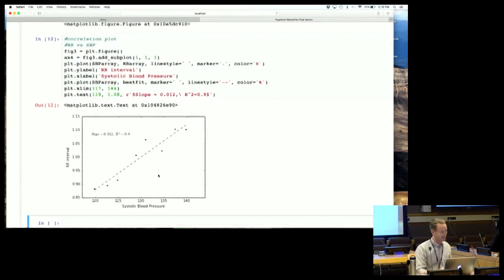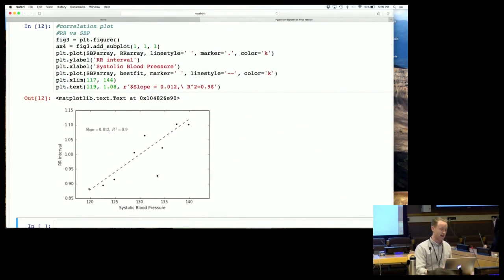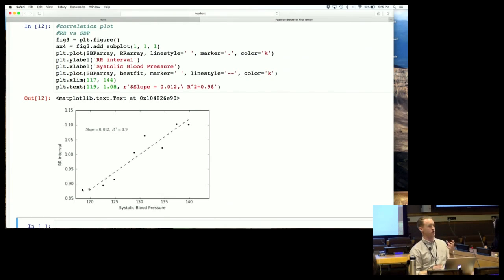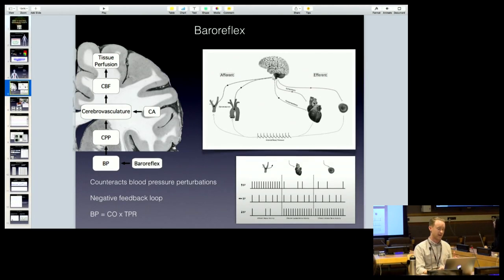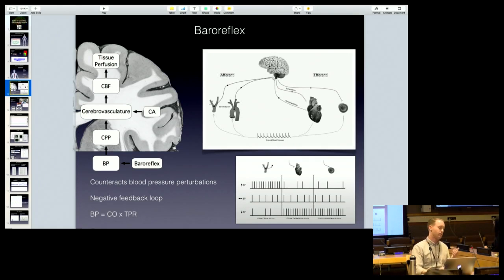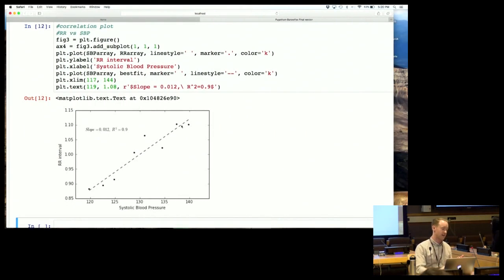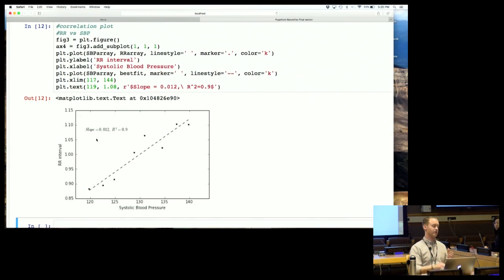After restarting the kernel - you can see here we've got systolic blood pressure versus time between each heartbeat. As systolic blood pressure drops, on average you have a decrease in the time between each heartbeat - basically as blood pressure is dropping, the system is telling the heart to increase heart rate to bring blood pressure back up. What we're calculating in the lab is all just to get this slope value - the greater the slope, the greater the increase in heart rate per drop in blood pressure.